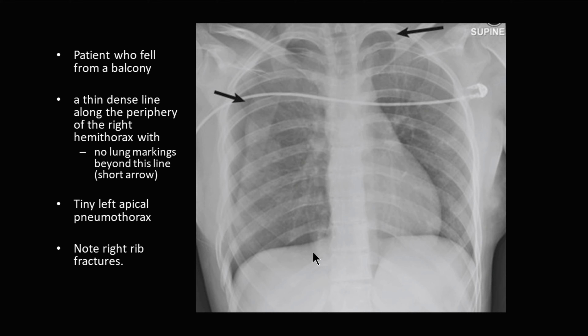Here's an example of what a pneumothorax looks like. You'll see this line running across the right-hand side — very faintly, these are difficult to see. This is a left-sided apical pneumothorax. Note also that there are several fractures within the ribs here that caused this pneumothorax.